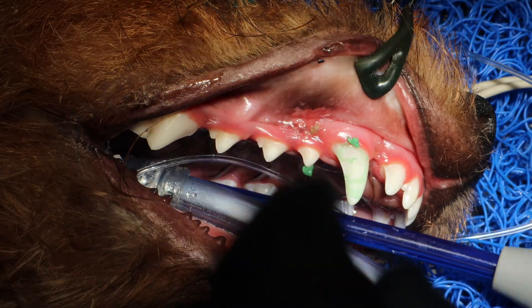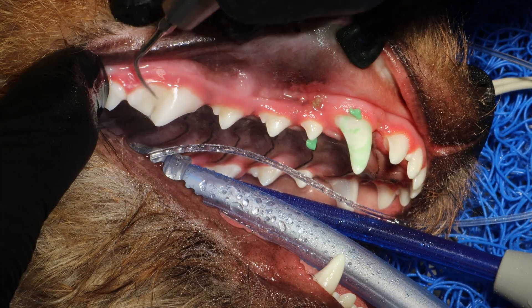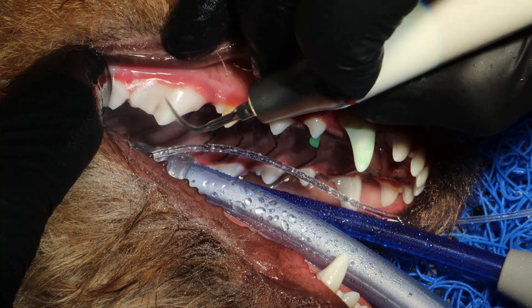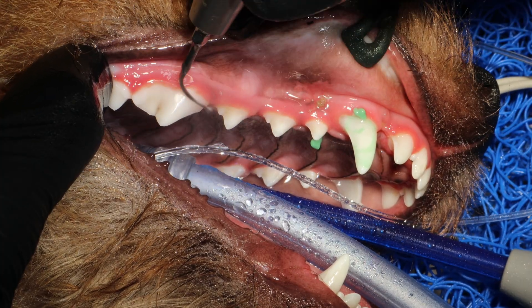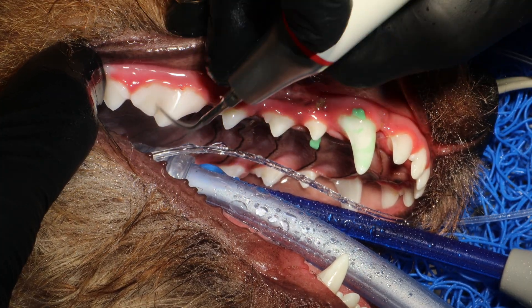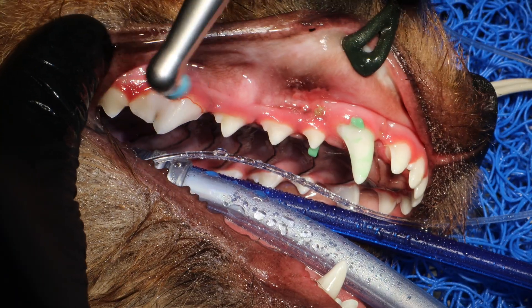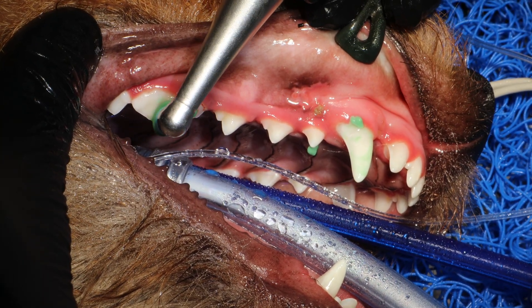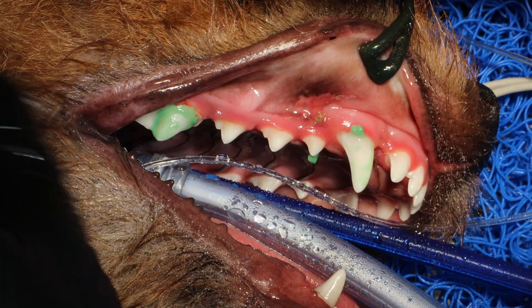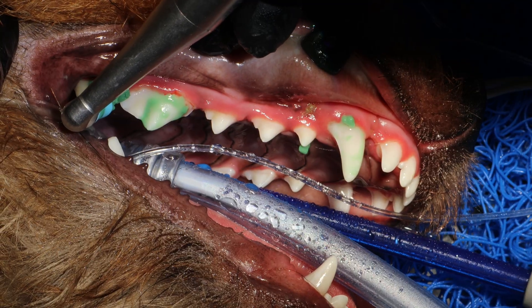I'm inserting a suction device here. It's always nice to have suction for these because you're spraying with a lot of water and you want to do as much as you can to avoid any aspiration. When I flush the acid away in a little bit, that will certainly help reduce any damage from acid touching the gums or gingiva. So give it a nice polish — I'm including three teeth in this correction.